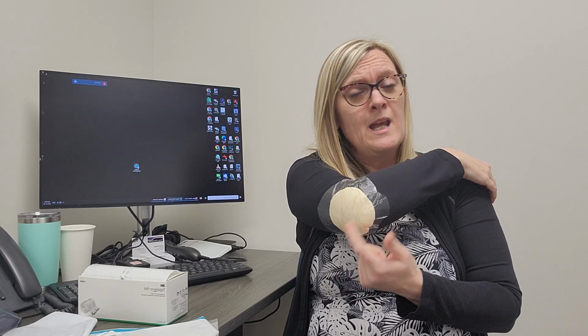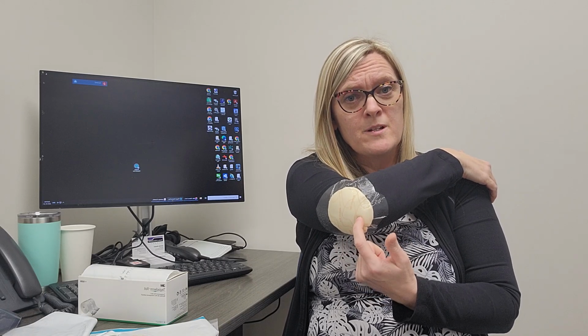Again, if you're going to be able to leave it on a week, often it is. If you are going to have to change it more because it's highly exudating, it may not, and you may have to go to a silicone. But I did want to show you how to make these, because they're not something that's available Ontario-wide, but we do have them in a lot of acute care facilities because we're able to make those clinical decisions and choices ourselves. So hopefully that helps to clarify that.